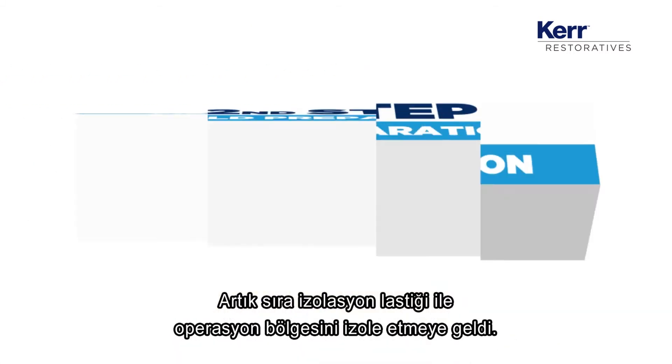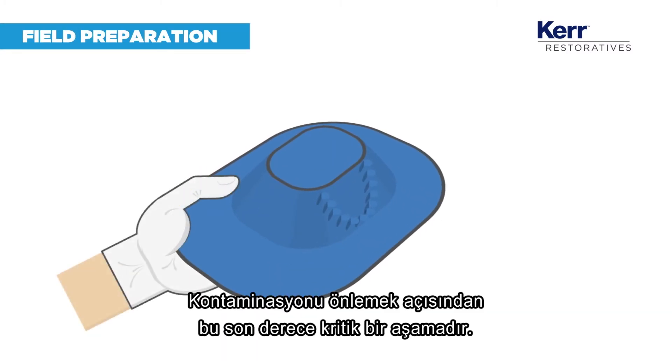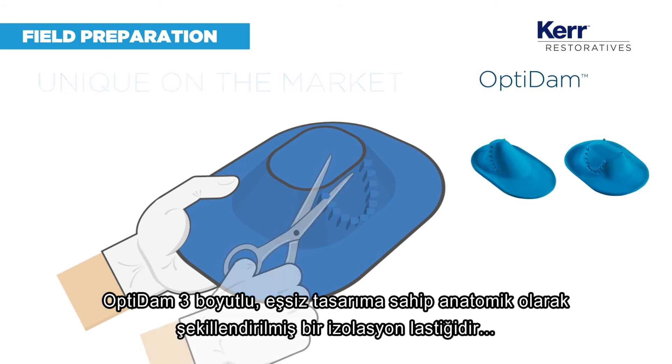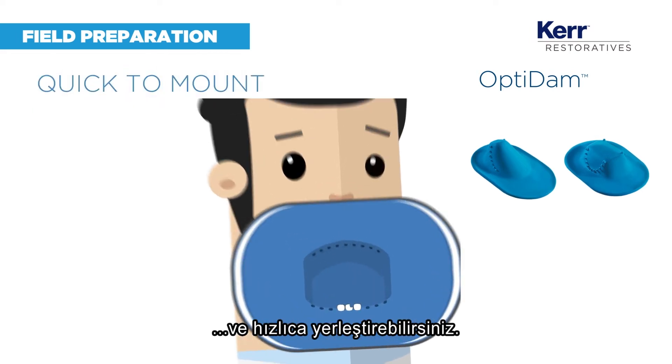It's now time to isolate the operating field with a rubber dam — a critical step to avoid contamination. OptiDAM is a 3D anatomical dam with a unique design which you can quickly mount.